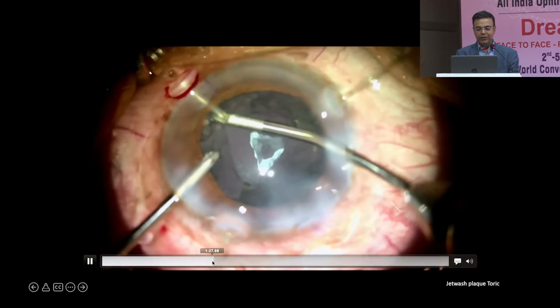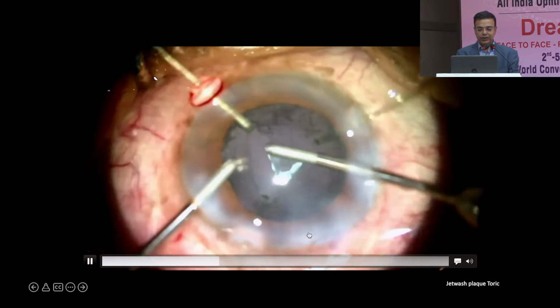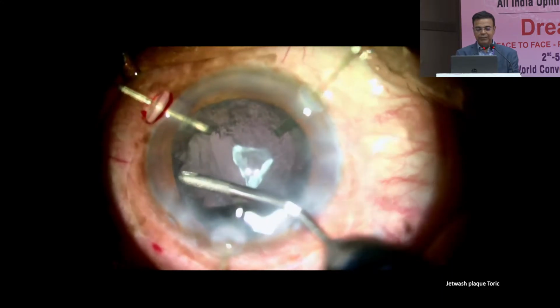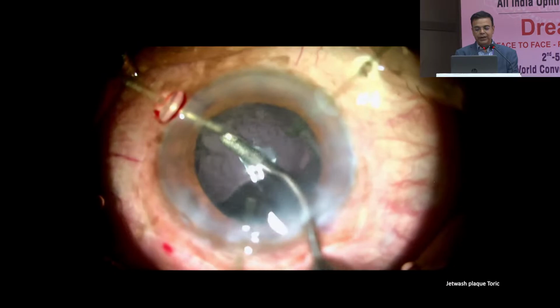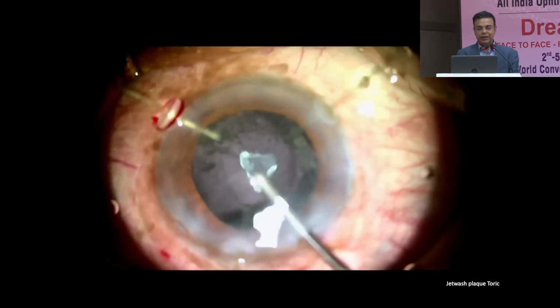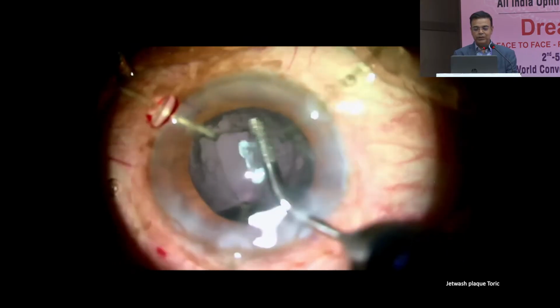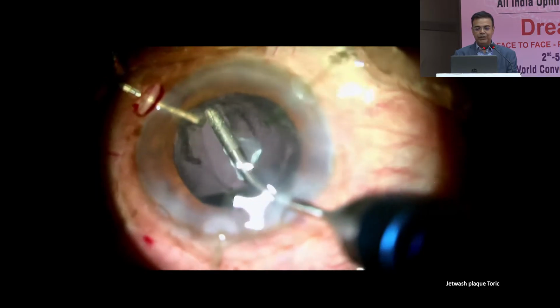You can see what I'm doing here. I'll go from the main port with only the infusion. I've just taken it back a little bit just to show you. So I go in from the main port, which is leaky. It's an infusion cannula which I'm now pushing in through the main port, keeping the posterior lip depressed. I've set up a high flow system where I'm doing a jet wash or a jet polish of all the stuck plaques and cortex and the equator of the bag where there is resistant cortex.